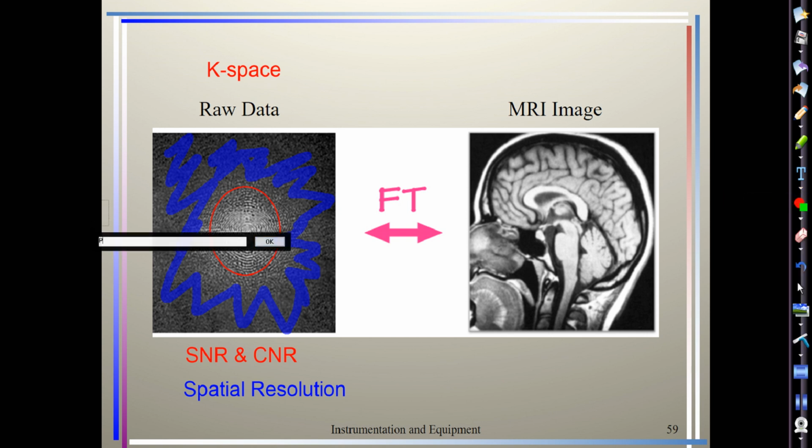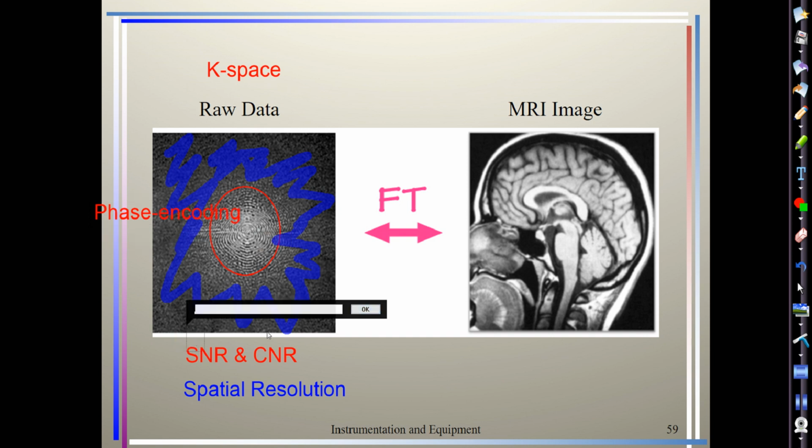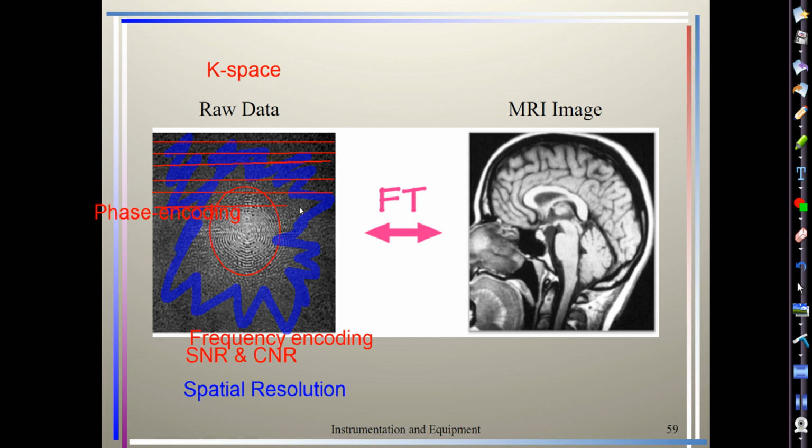In your K-space, sometimes we have on the horizontal row, those are your phase encoding direction. And then down here would be our frequency. And it really is just like a big grid. Big old matrix. You got all the lines of K-space.